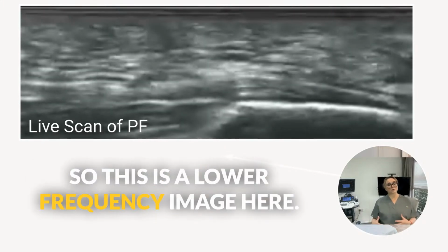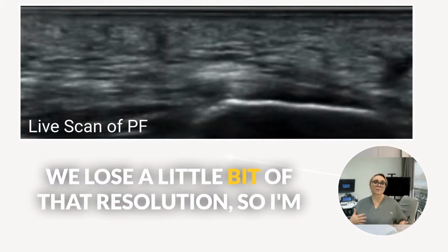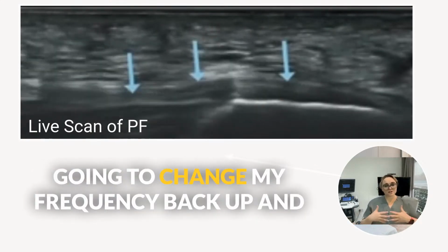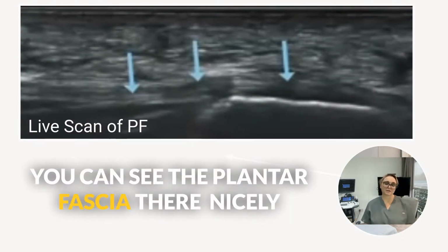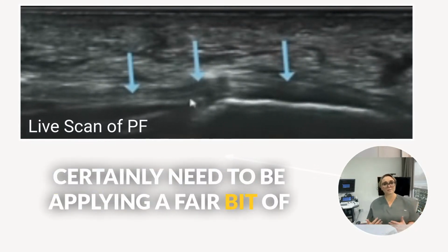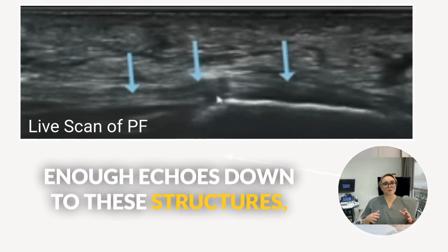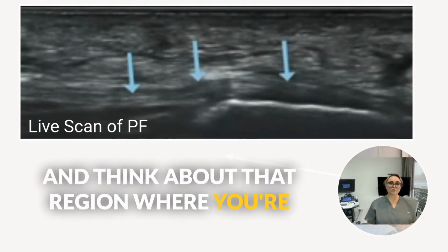So this is a lower frequency image here. We can see the plantar fascia very nicely, but we lose a little bit of that resolution. So I'm going to change my frequency back up, and you can see the plantar fascia there nicely onto the calcaneus. Certainly need to be applying a fair bit of probe pressure here as well to get enough echoes down to these structures, and think about that region where you're going to measure.